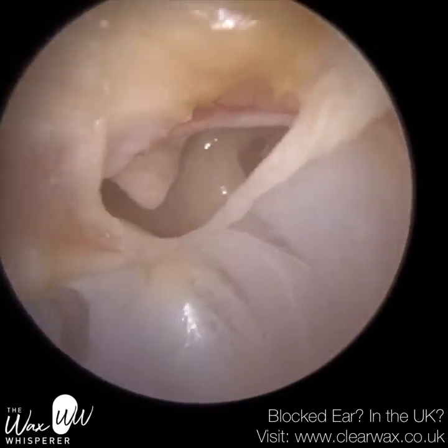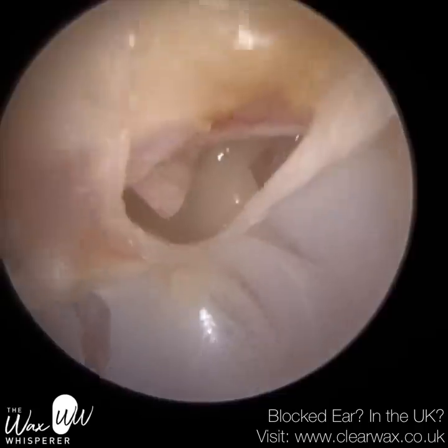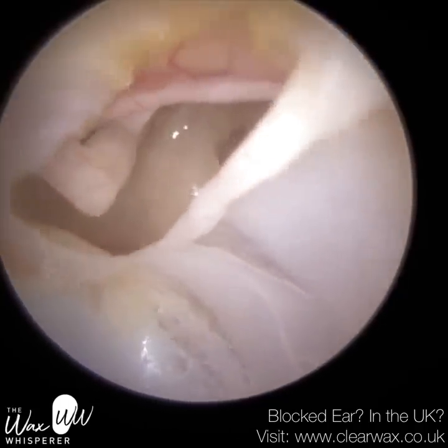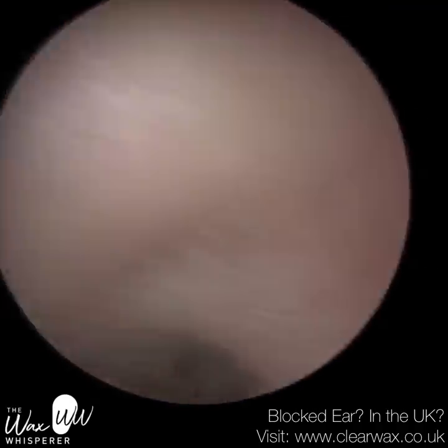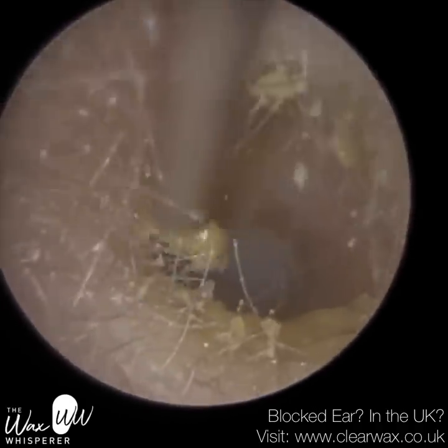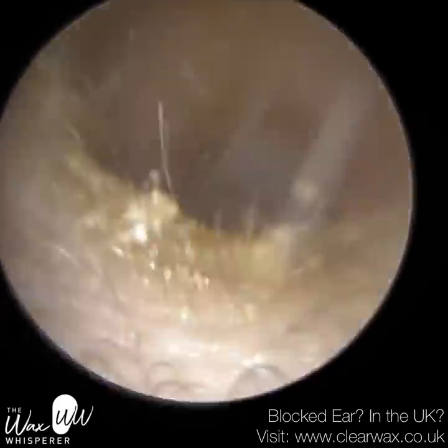Here is patient one's perforation — it's a posterior perforation. They were completely unaware they had this. Whenever you do ear wax removal, it's happened before where patients had a perforation and pointed the finger, thinking we caused it. So I was a bit worried at first, but obviously the patient didn't experience any pain or discomfort. They're fully aware it wasn't caused by us. We've got a video — this is why the iClearScope is fantastic — we can record the procedure and play it back. They remembered when it potentially may have occurred: it was whilst they were swimming and diving.